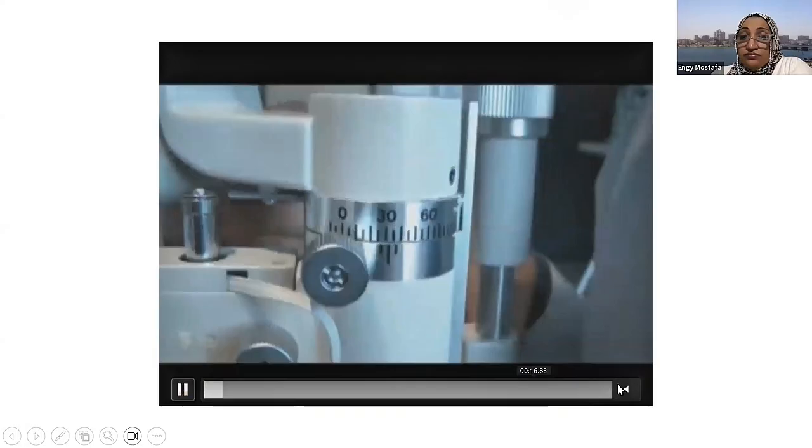Some people use the 800 cutoff point, while it is better for us to use the 1,000 cutoff point. Of course, specular microscopy is very important before keratoplasties, so that we don't end up with corneal decompensation.